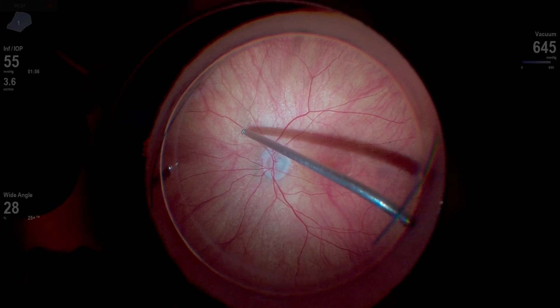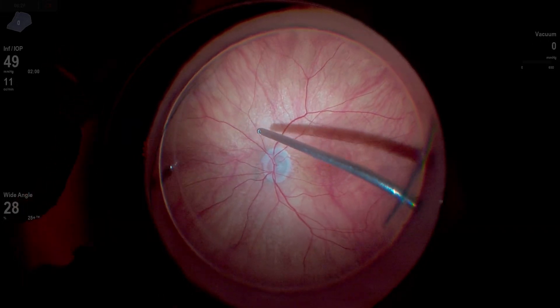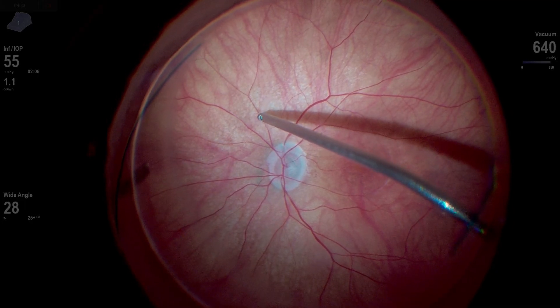Working on that nasal vitreous, which was really stuck down just nasal to the optic nerve — probably could use a little bit more magnification. There we go. As we're elevating things, we do get it up.